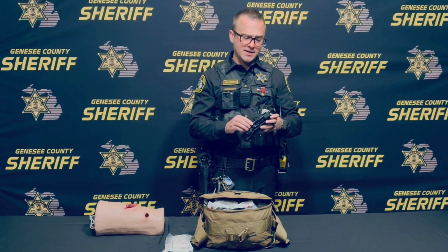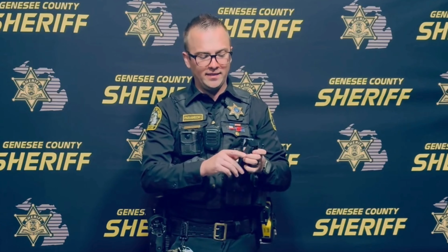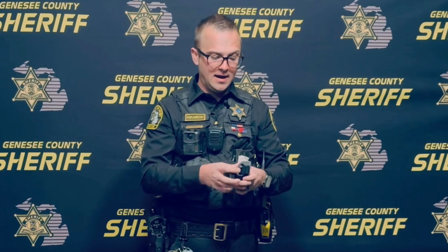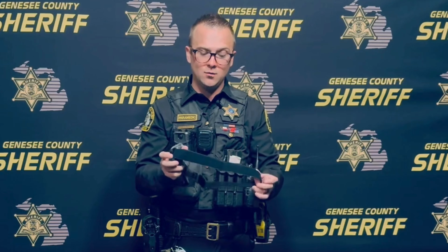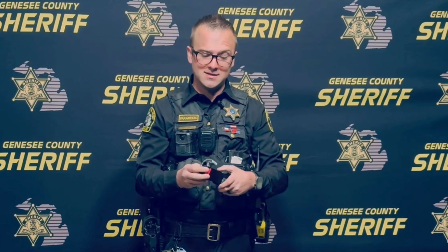The tourniquet itself is made up of essentially 4 very important parts. The stick that you see on the front, this is called the windlass. You obviously have a windlass lock. There's a strap to secure the windlass in the windlass lock and note the time that the tourniquet was applied. And then obviously there's a very large strap which can be adjusted to size. It's made of Velcro. It Velcros onto itself.